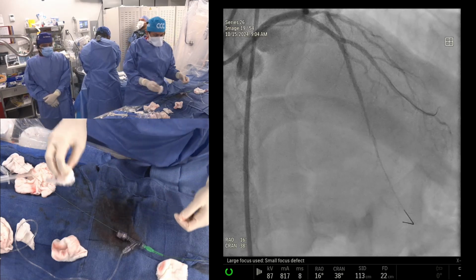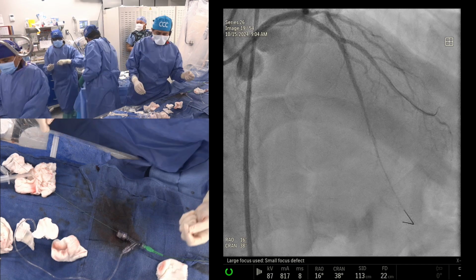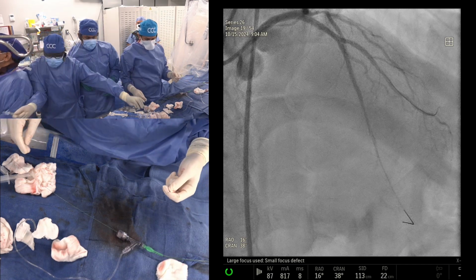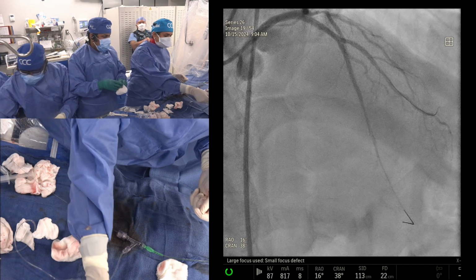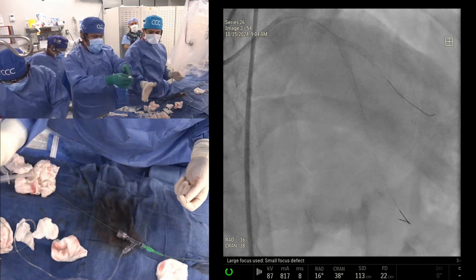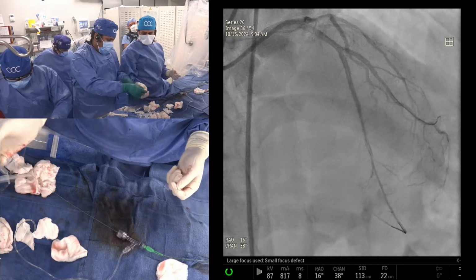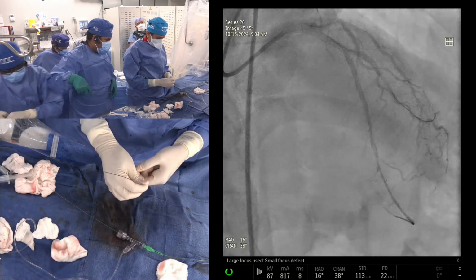I mean, a very strange observation. You have a 25-30% something you see commonly. You think there is a little myocardial bridge in the mid portion of the diagonal? Yes, we could see that. Several suggestions, mainly talking about that, outside the US, this is straightforward.